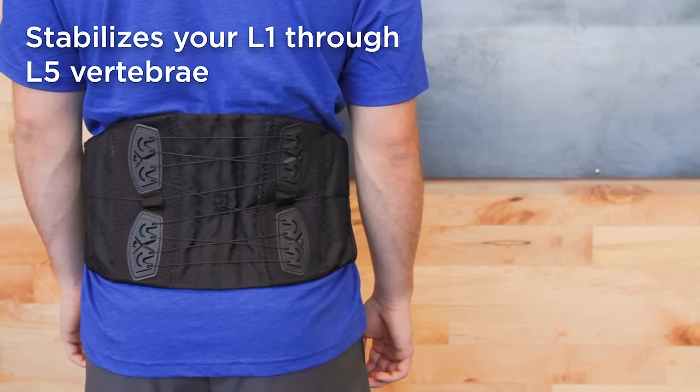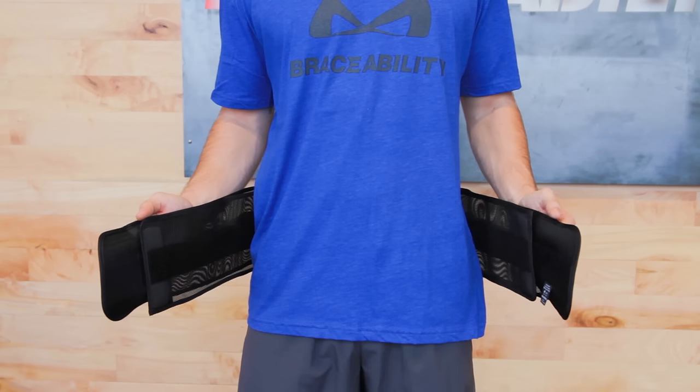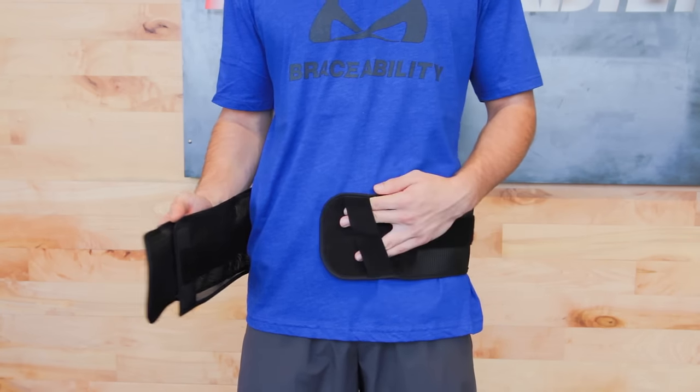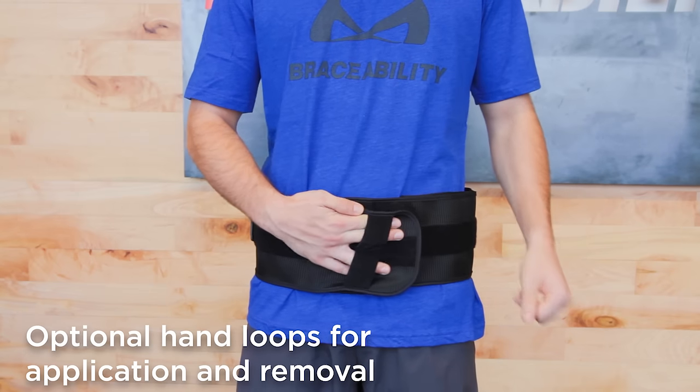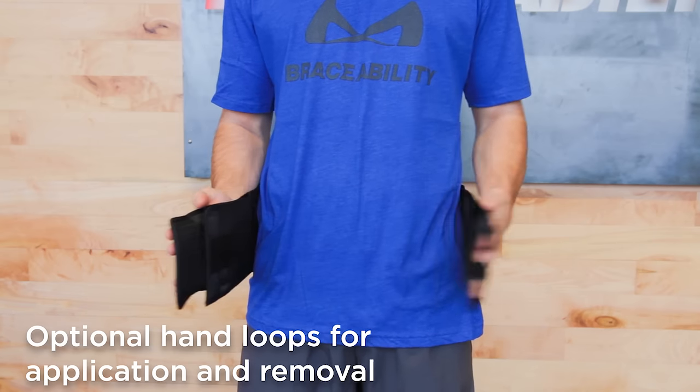This brace helps stabilize your lower back, specifically your L1 through L5 vertebrae. If you have limited upper body strength or arthritis, don't worry — the hand loops will still allow you to apply and remove the brace without any assistance.